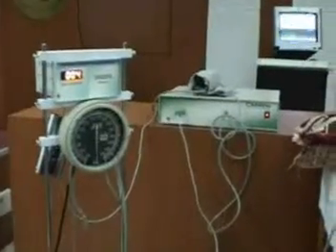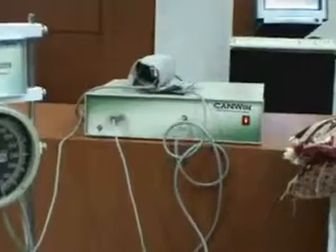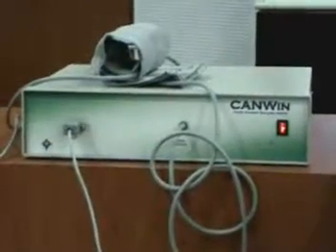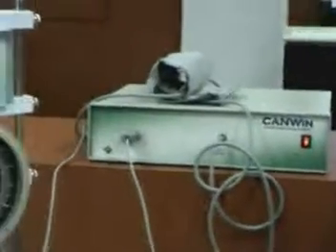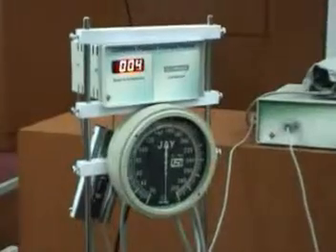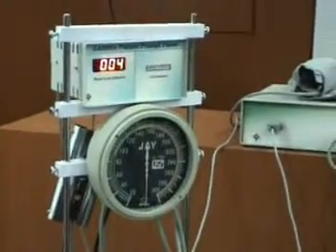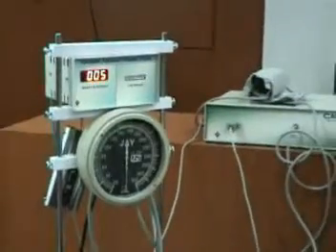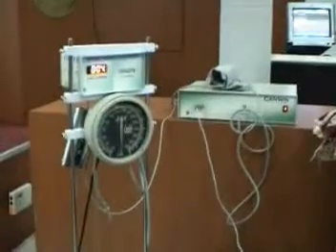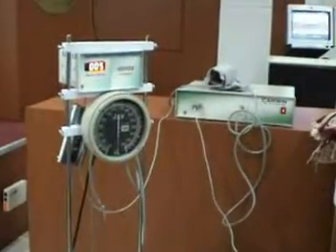CANWin is the state-of-the-art PC Windows-based cardiac autonomic neuropathy analysis system. What we are seeing here is the machine with the control panel, which is seen on the left-hand side. It analyzes both the sympathetic and the parasympathetic autonomic nervous system response of the patient. The system uses tachocardiogram and automatic non-invasive blood pressure measurement to conduct a battery of 6 tests.